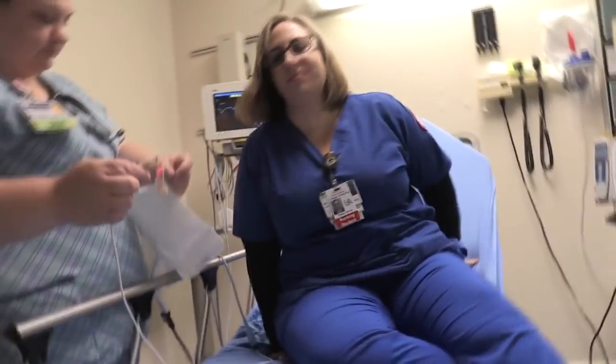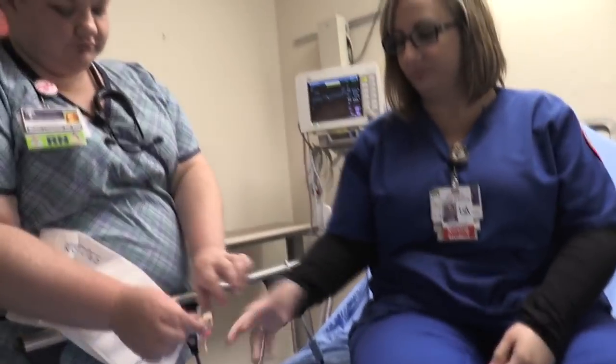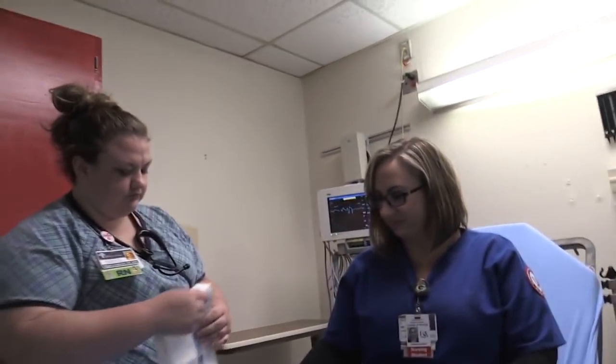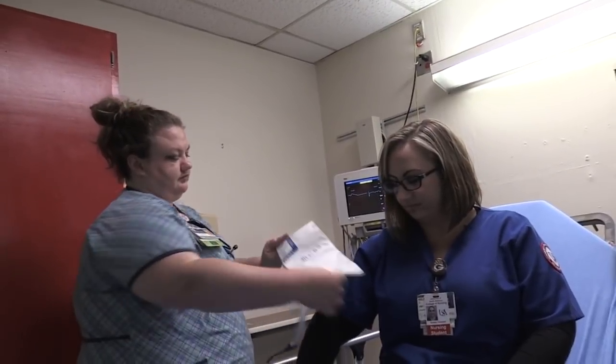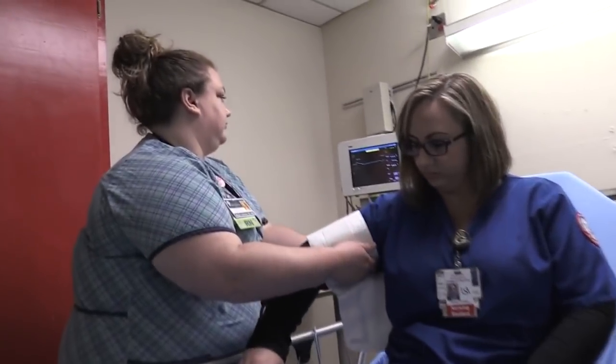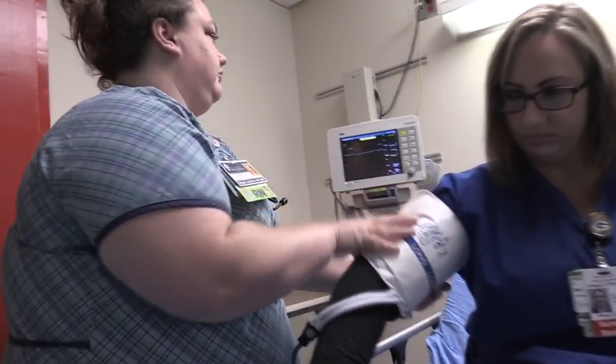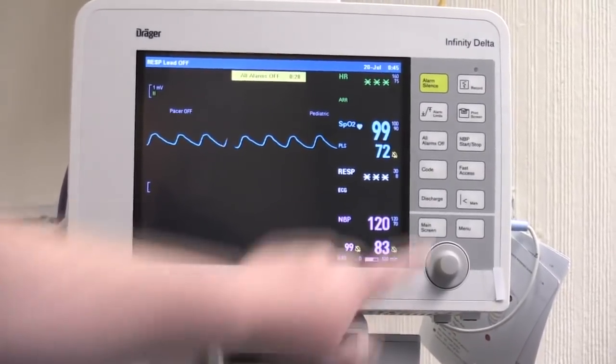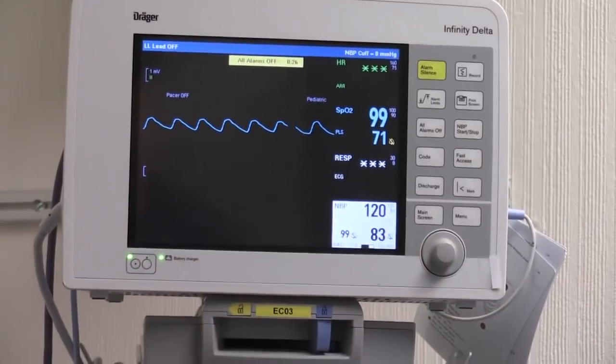So we have a second patient here, and we're going to try the same thing. And this is a nursing student who's volunteered to participate in this experiment. Okay, so the pulse oximetry is working. You've got a good waveform. Blood pressure cuff's going on.